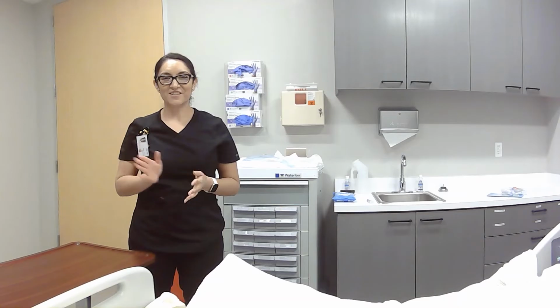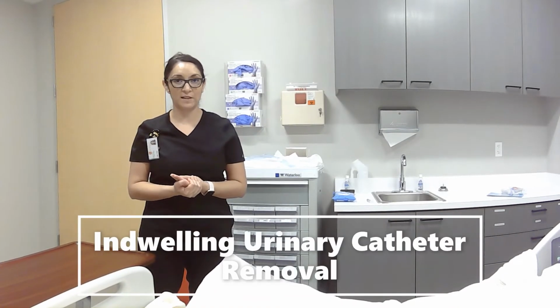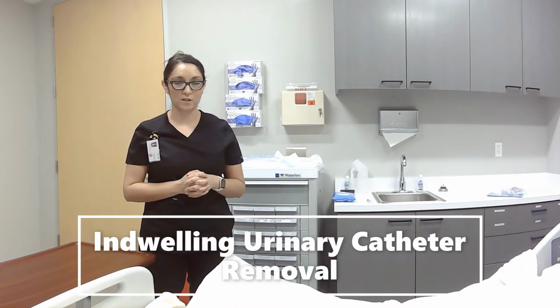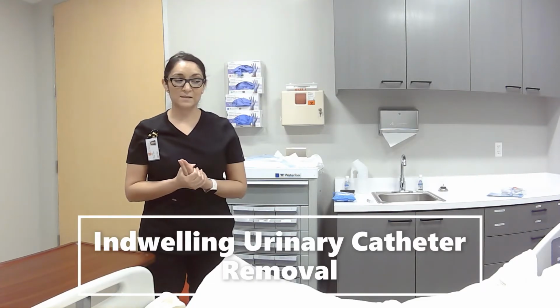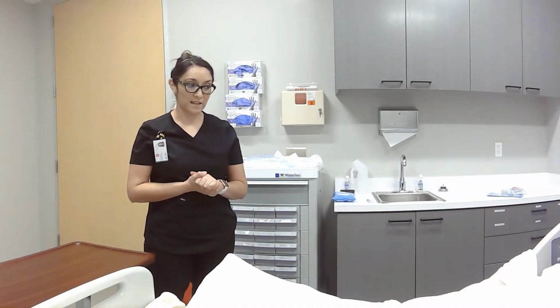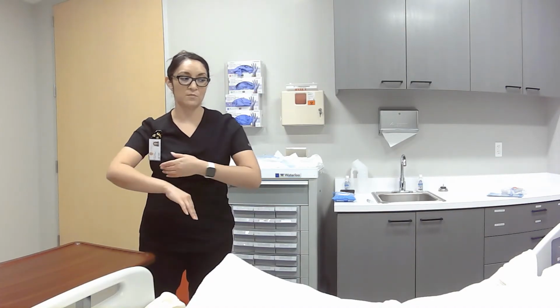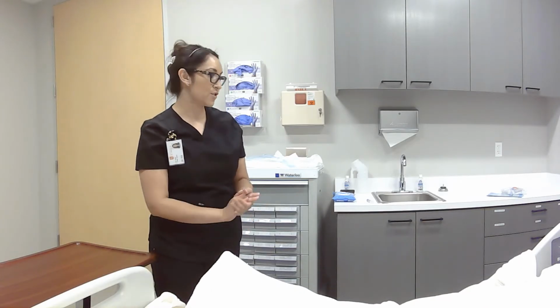Hello again, future nurses. So we went over how to insert a Foley catheter, and now we're going to go over how to discontinue or how to remove a Foley catheter or an indwelling urinary catheter. So we're going to remove Miss Adams' Foley. She has been voiding pretty well, so we're going to see how she's able to urinate on her own.